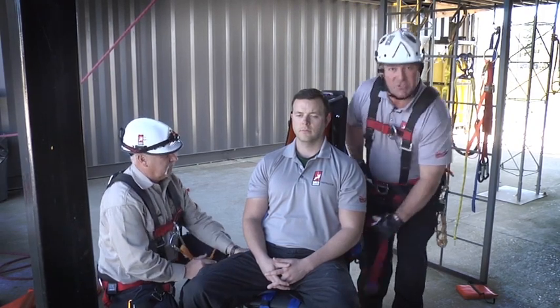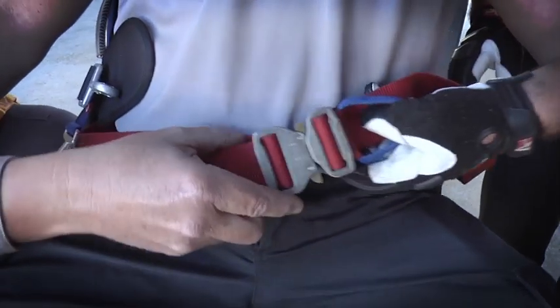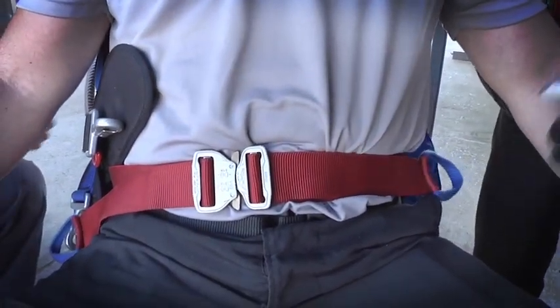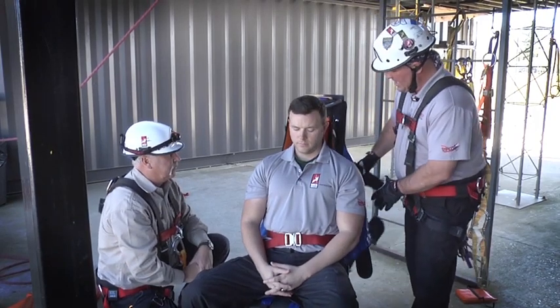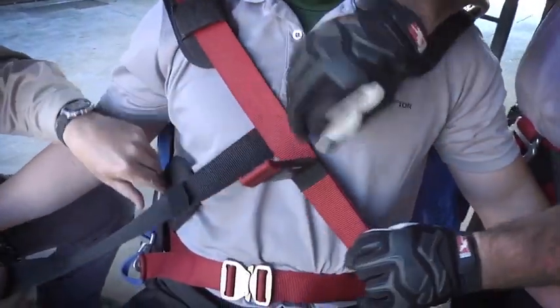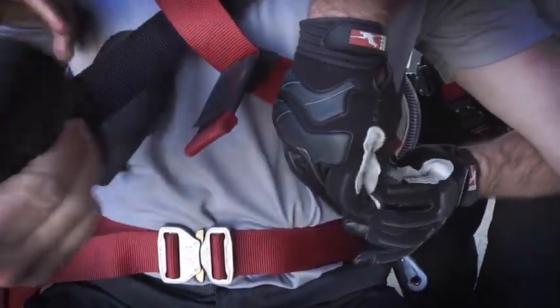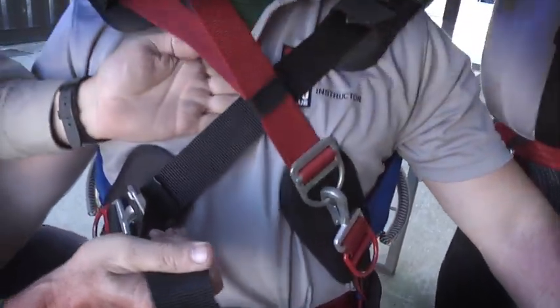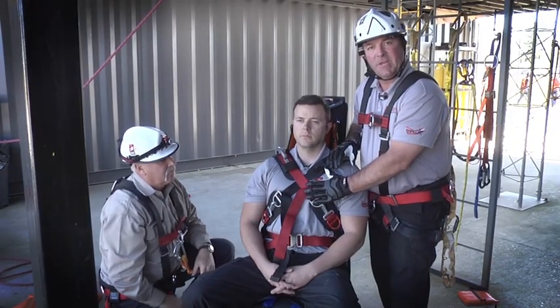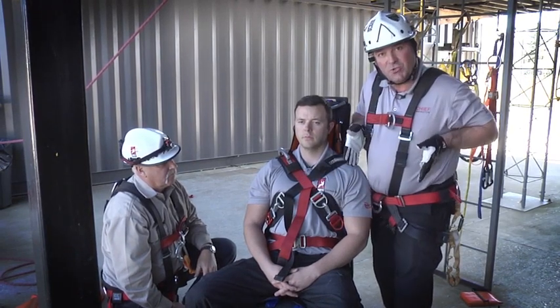Now how do we apply it? The first application strap is going to be the red strap. Pull it tight with two finger widths underneath — we don't want it so snug that it's discomfort to the patient. Next, we're going to come over with our shoulder straps: red to red buckle, black to black. Notice we use an X configuration here. If you have a larger patient and this X is riding up on them, you can also do these buckles straight down.